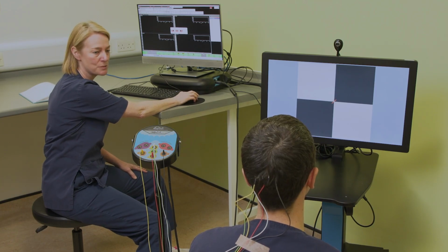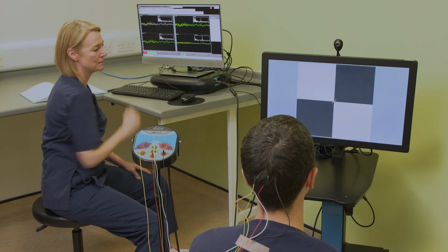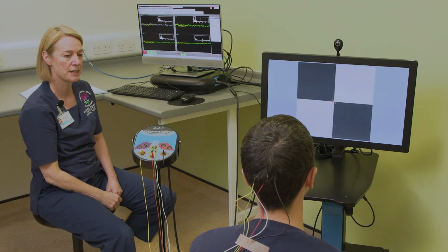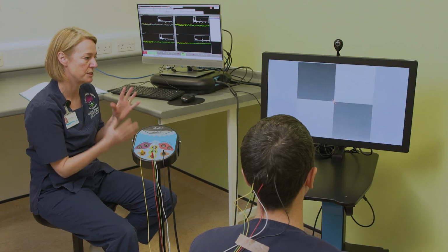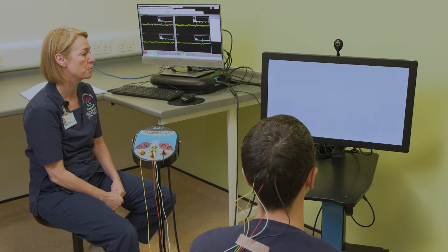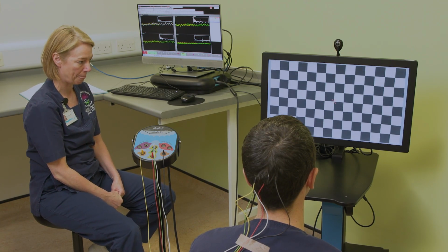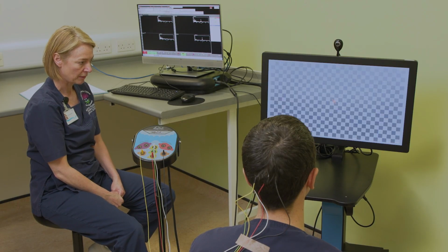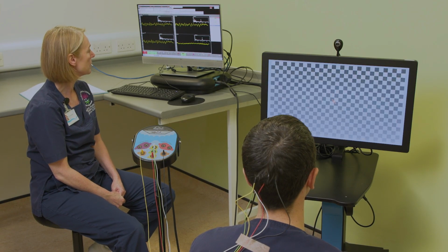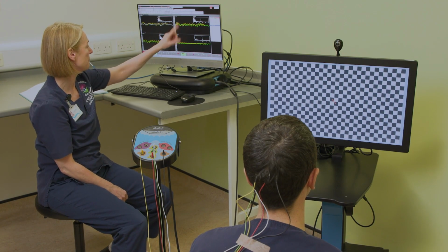at the Children's Hospital. So you can see that Bruce has 3 electrodes across his occiput, a frontal reference electrode, and a virtual ground on his left mastoid. That gives us 3 VEP channels, and we create a 4th Laplacian channel by using the average voltage at O1 and O2 as a reference for OZ. Laplacian channels are good for small signal conditions.